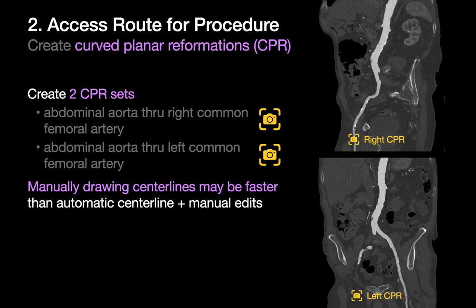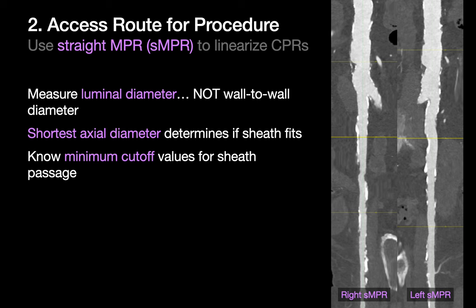After you've created your CPRs, do a final careful visual check to make sure the center lines are true, and then do an export or movie capture of both CPR sets for your referring provider. You're then ready to do measurements, which will require you to linearize your CPRs using the straight MPR tool. Since you need to make sure that the sheath through which the undeployed TAVR is introduced can actually fit, the diameters you measure need to be luminal diameters and not wall-to-wall diameters. While many IFUs may allude to mean luminal diameters, what tends to really matter is the shortest axial diameter of the lumen so that the sheath will actually fit.